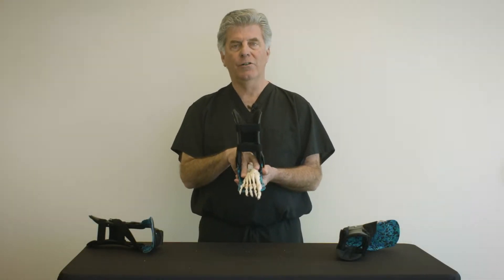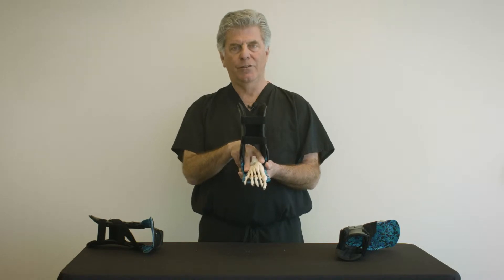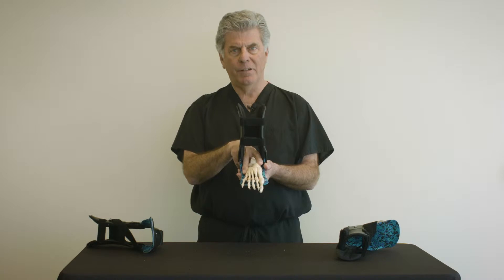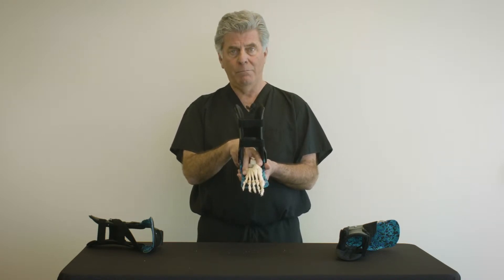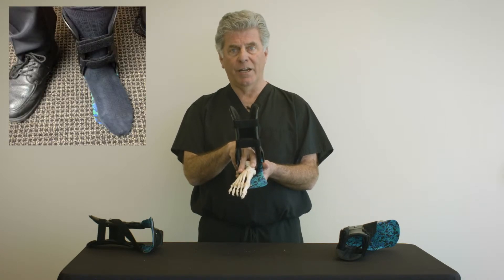One challenge when treating the adult acquired flat foot is controlling forefoot abduction. Often times the patient will be fitted for a foot orthosis or a brace and they will then be observed to be slipping laterally off of the orthotic foot plate.